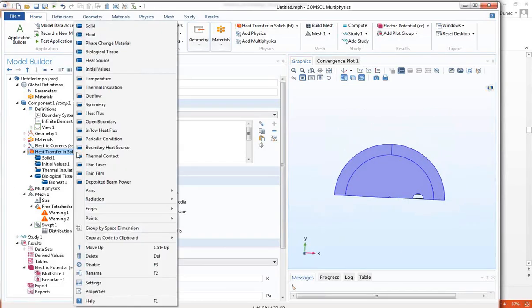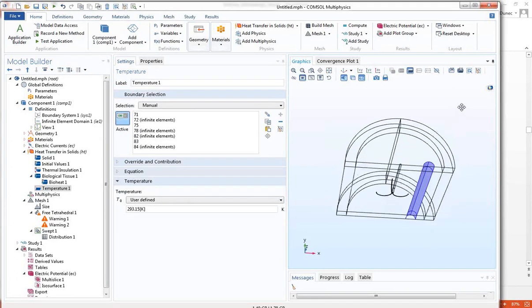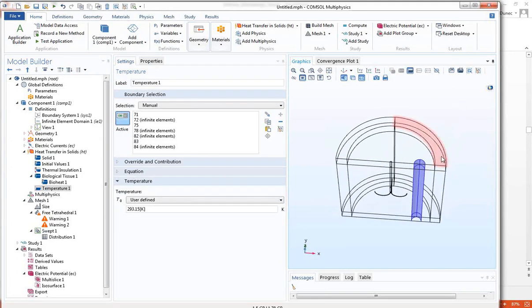So I'm going to right click, I will choose a temperature boundary, and I'm going to use the box select, and then box around those elements right there. Okay. Now, I think I might have caught the tip there. So let me deselect the tip just in case. Right there, yes, just in case.